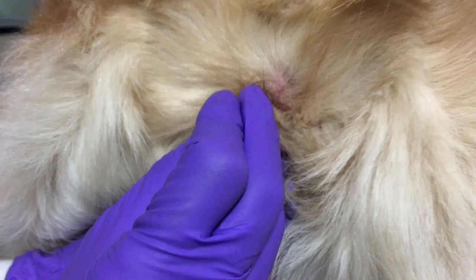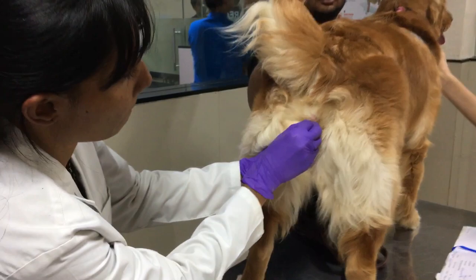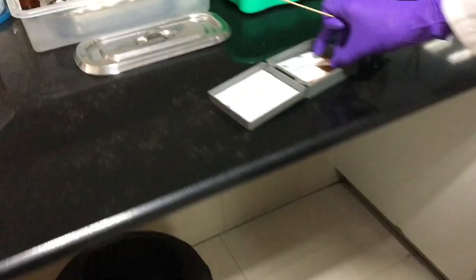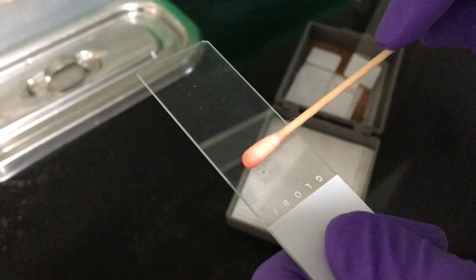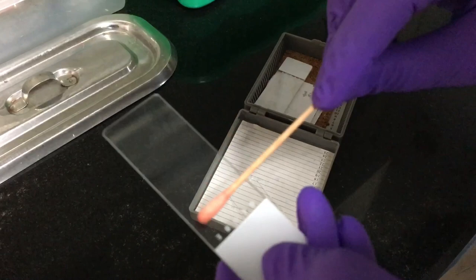Roll the swab in a circular motion so that you can get all the cells, and gently remove the swab. Now take two glass slides and gently roll the swab on the surface of the slide. Do not apply excess pressure while doing this. The smear should be dried before staining and then it will be ready for examination.